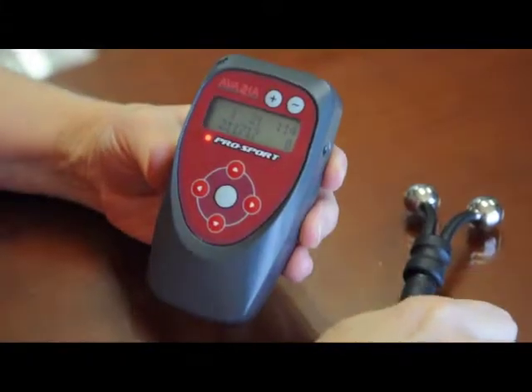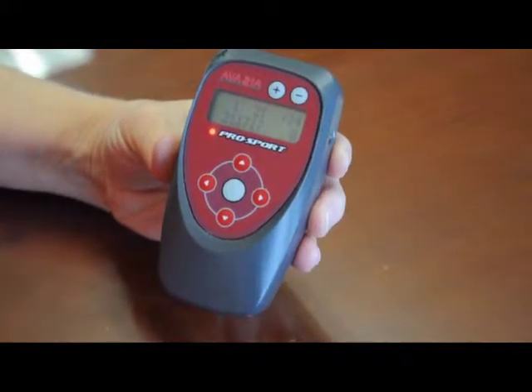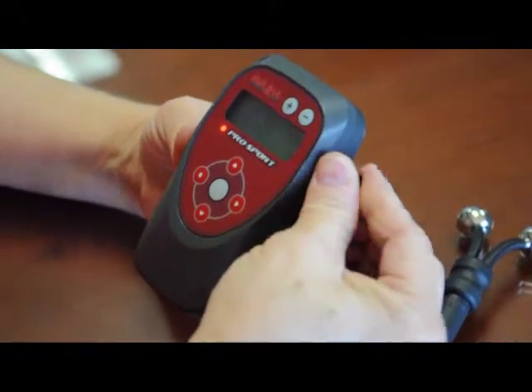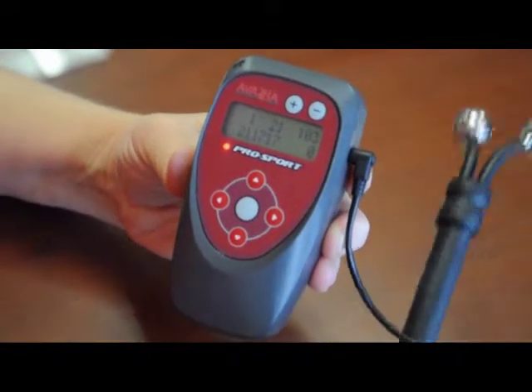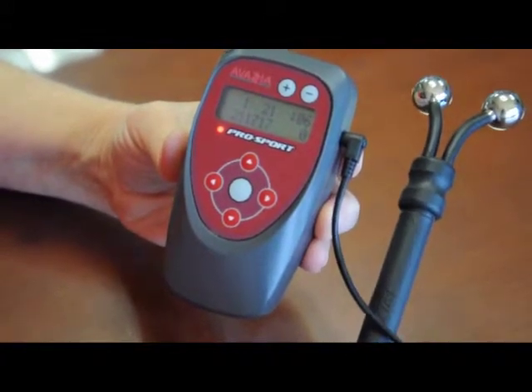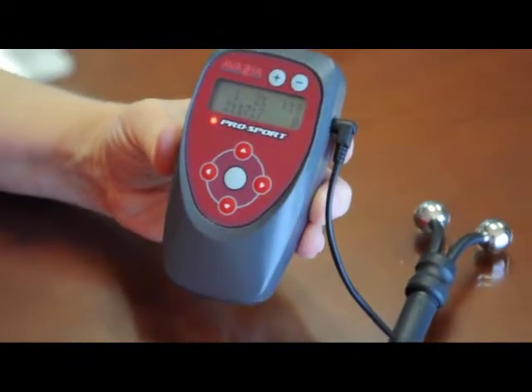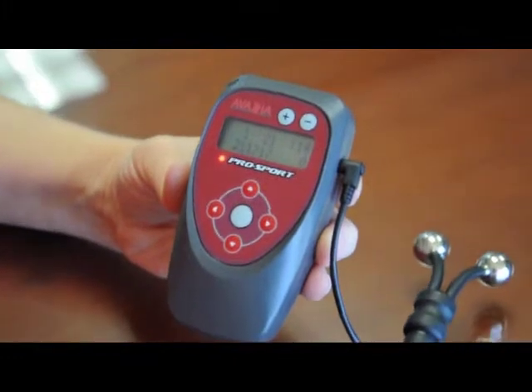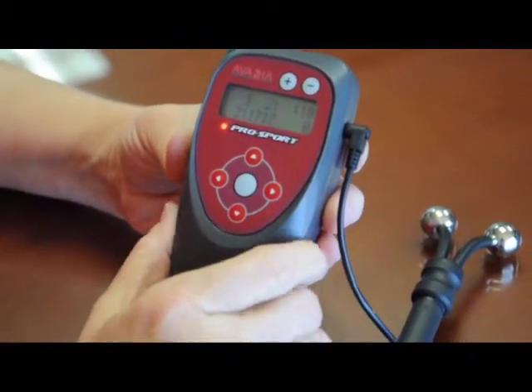I can remove the accessory and the timer will stop, indicating that the device thinks it's off the body. Then when I replace it again, the timer starts up again as if it's on the body — but we can see it's not. So what we're going to do is recalibrate the threshold to improve the situation, because this accessory and lead wire are acting as a small load which the device thinks could be a body.